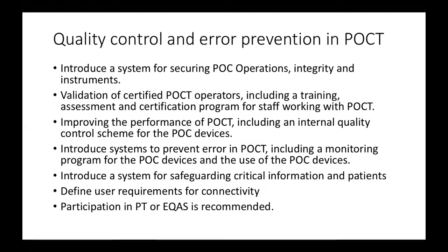These are well maintained. And these operators are trained, and then you are checking their competence, whether they are able to perform a particular test in a practical situation or not. For that, you are providing training, and after that, post-training evaluation. You are developing some internal quality control system for your point of care devices, and how we can prevent error.